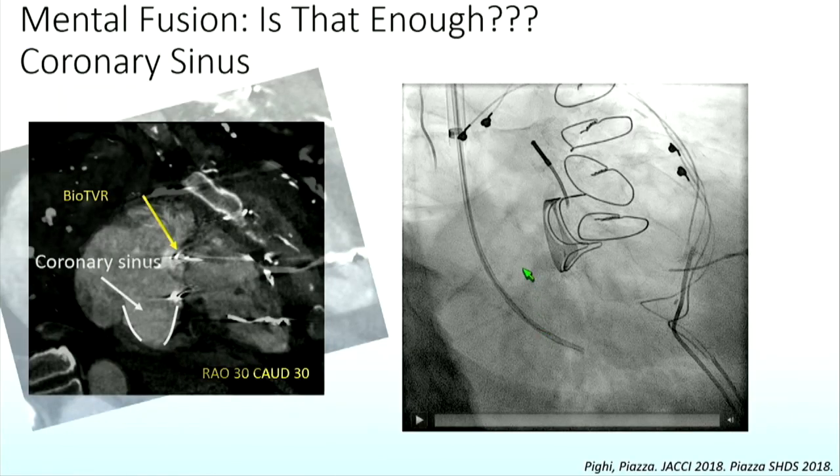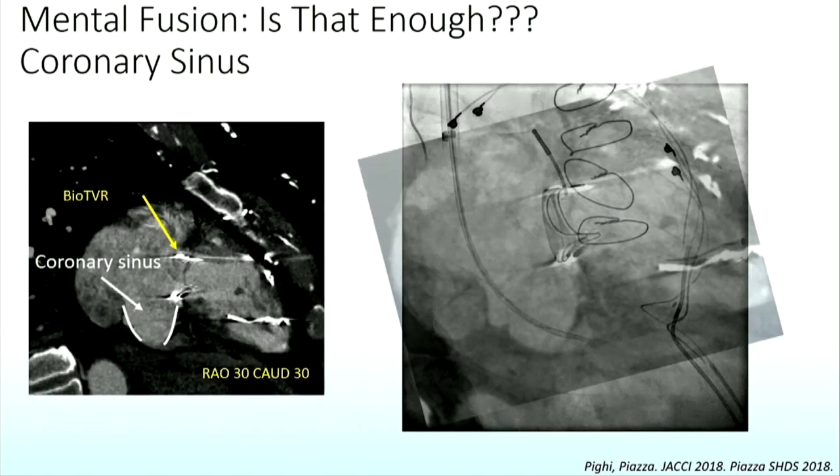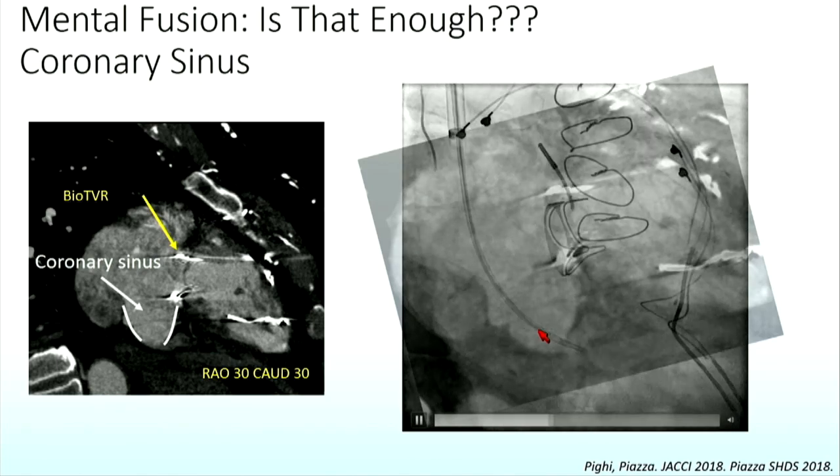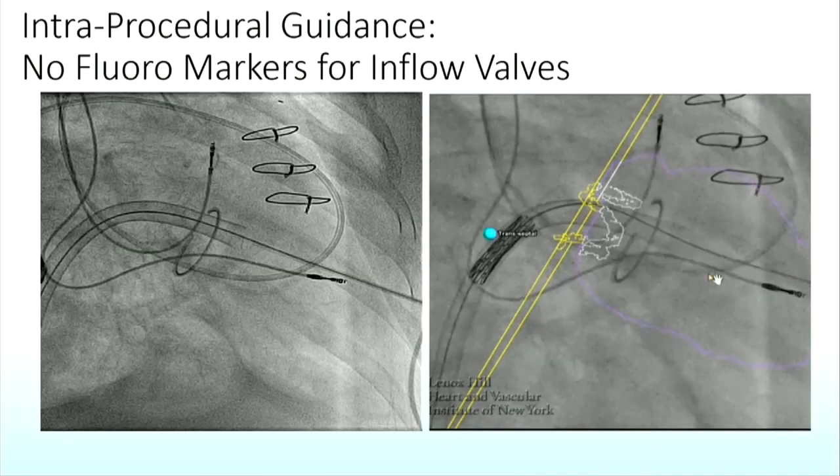Well, what have we done in the past and what are we doing currently? Well, we're taking our pre-procedural CT, our echocardiogram, we're merging it in our heads and overlaying it onto X-ray for a therapy, and this is one case of a coronary sinus indirect annuloplasty device. How we take our imaging, plan our device therapy, and implant it with this imaging in mind.